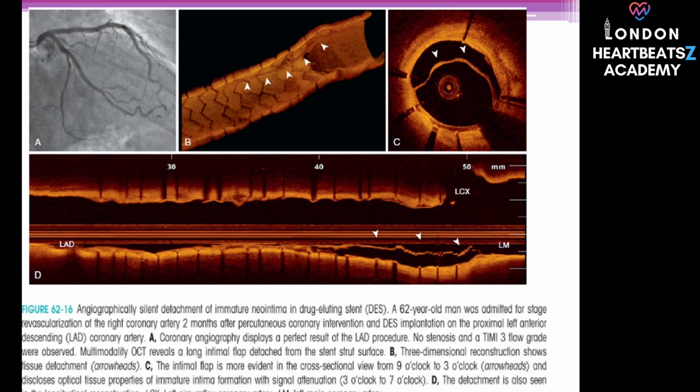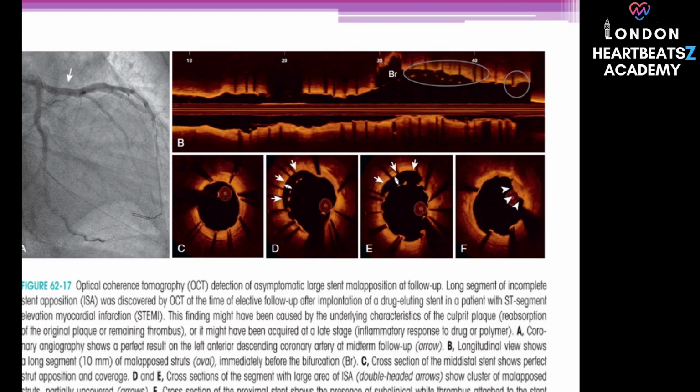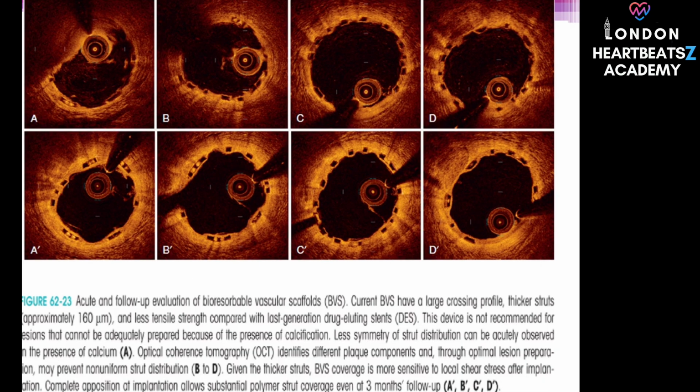Remind us of the resolution difference again. OCT is 10 to 20 microns axial resolution versus IVUS around 150 microns, roughly 10 times better. But the penetration depth is the trade-off. Correct. OCT penetrates only 1 to 2 millimeters, while IVUS penetrates 4 to 8 millimeters. Because of this resolution difference, IVUS has limited ability to reliably detect subtle intimal tears, thrombus, and incomplete stent apposition. Things OCT sees well. Yes, OCT clearly visualizes intimal hyperplasia, intraluminal thrombi, stent edge dissection, mural thrombus post-PCI, individual stent struts, and detailed plaque characteristics.